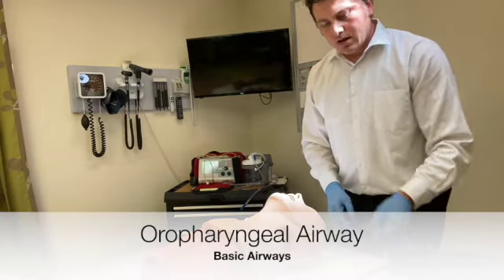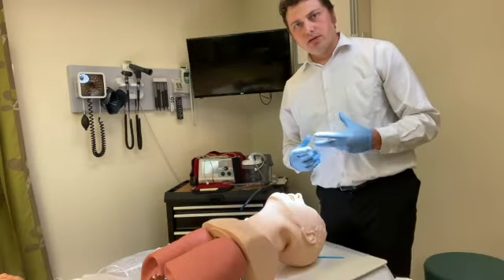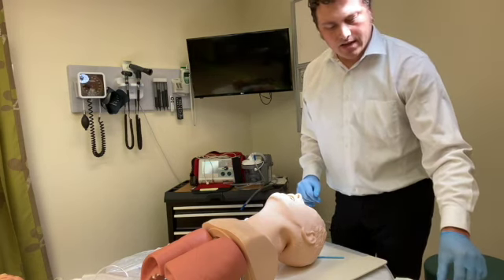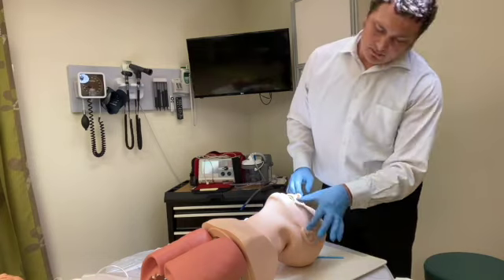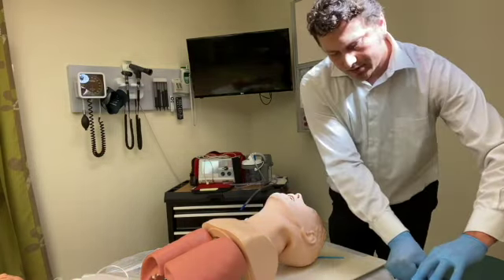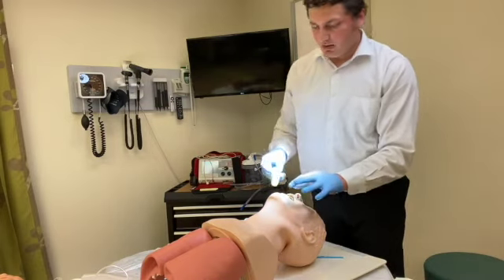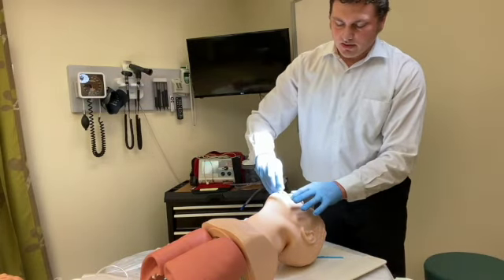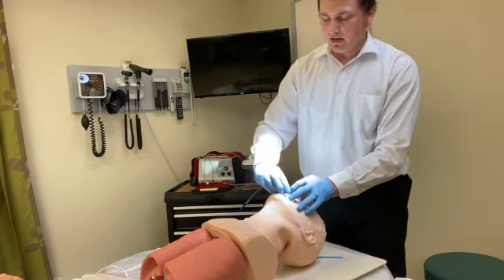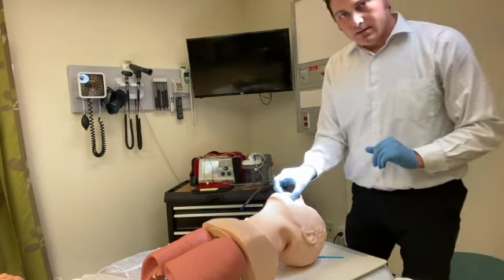Oropharyngeal airway can be used only in an unconscious patient where their gag reflex will not be intact. So you want to measure from the corner of their mouth to the angle of their jaw. Okay, so I'm measuring that out with the OPA right here. So have it tilted up, turn it around, right there in the mouth like that. That's your OPA.